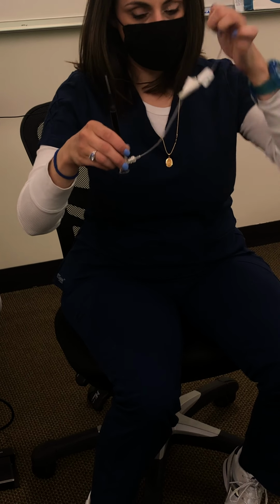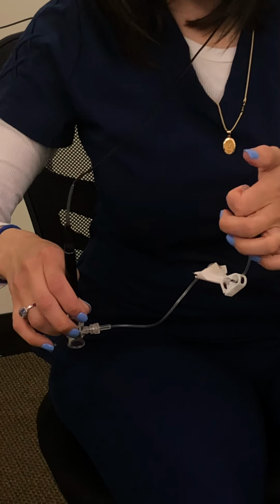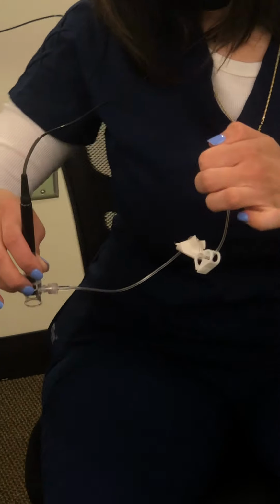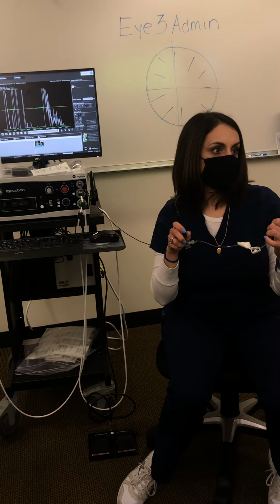So you've got your bottle here. You're just gonna squeeze. It's gonna fill up the shell, but you still have to hold this on the eye. My left hand doesn't work as well as my right, so you've gotta squeeze it, and then you've gotta hit the foot pedal and watch the screen. So it takes a lot of coordination.